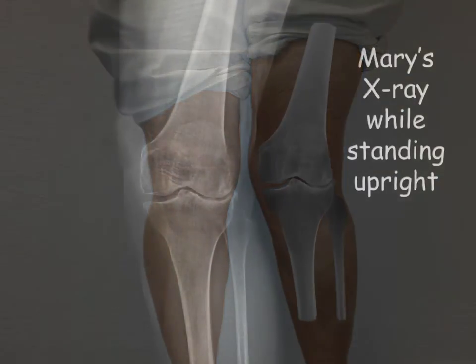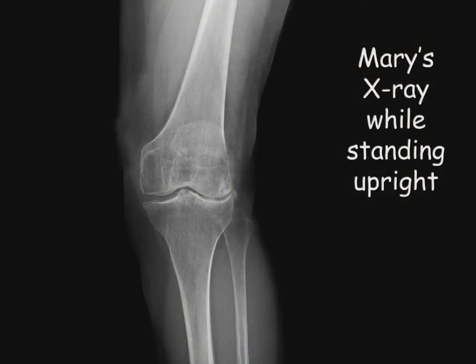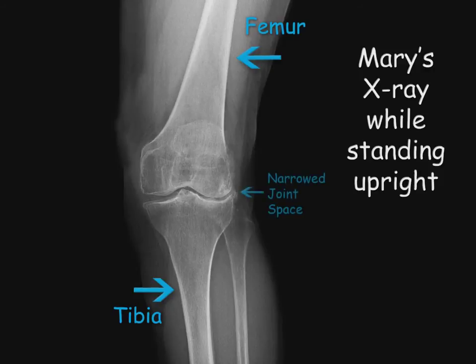Let's review Mary's standing x-ray in more detail. The top bone is the thigh or femur bone, and the bottom bone is the shin or tibia bone. The knee is a hinge joint where these two bones meet together. In Mary's knee there is a loss of cartilage with the development of bone spurs called osteophytes.